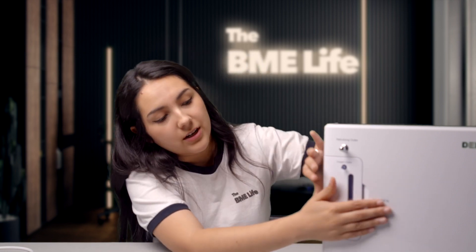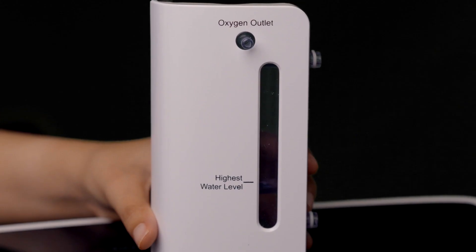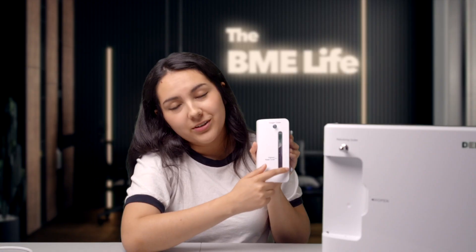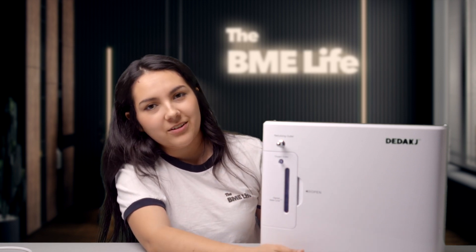When I first opened this product, I thought it looked very intense and complex, but it's actually pretty easy to use. All you have to do is first fill up the water tank with clean or pure water — buy distilled water or boil water and let it cool down before filling the tank. Once you fill it up to the highest water level line, you can put it back in the machine.